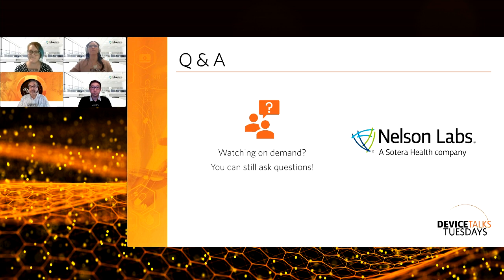I don't know if Audrey or Lucas have additional thoughts. Yeah, in my experience, cytotox testing on an aged device, whether it's accelerated or just ambient storage aged, has been sufficient. I do want to throw in, if you have a reusable or a reprocessed device, that's kind of different, because that's when it really gets a little more complicated, where the reviewer wants to see any kind of potential cleaning residual buildup or anything like that. So there's a little more legwork that has to be done for those, because then you actually need to expose those devices to a certain number of cleaning cycles to show that despite all the exposure to any kind of cleaning detergents, it's still considered safe.